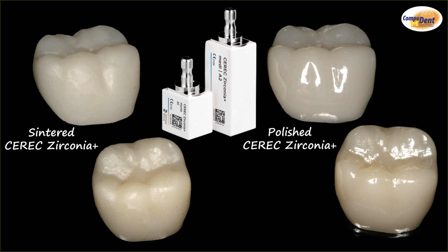Because the contouring step is where you get the smoothness. If you spend a little time there, get rid of your mill marks, get rid of the grooves, do a nice job there, the final step is pretty quick. It'll bring up the gloss really fast, and you get a smooth surface. If you quickly go through the contouring step and focus on the polishing sequence, you're going to get the gloss, but you're not going to get rid of the roughness as easily, because the final step is just about the gloss, not about making it really smooth.